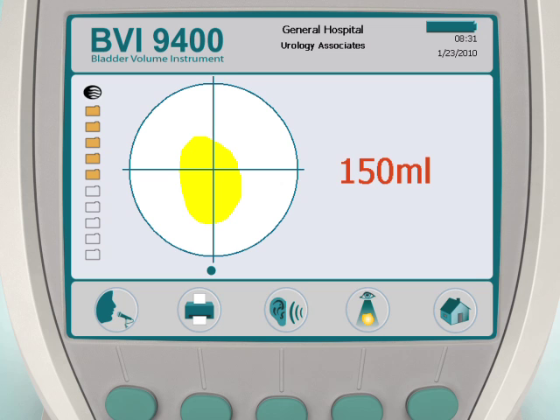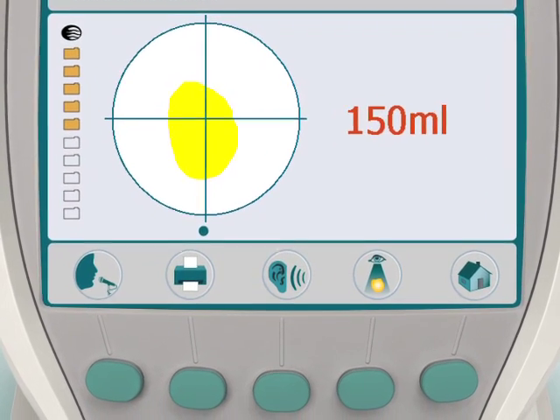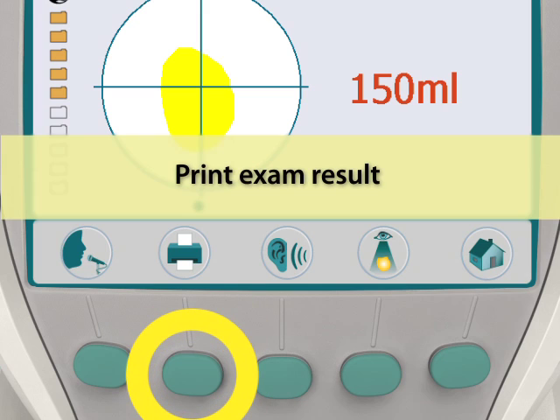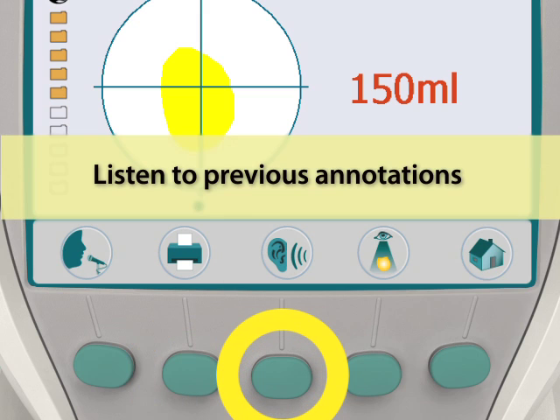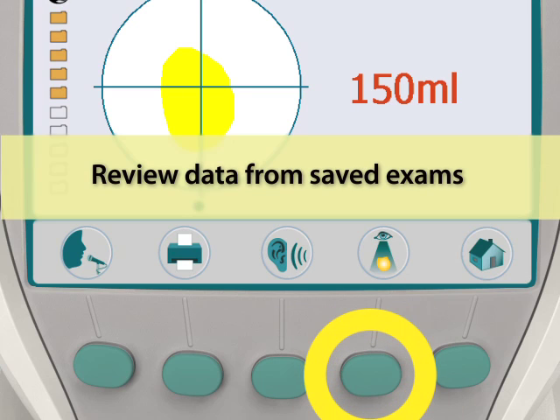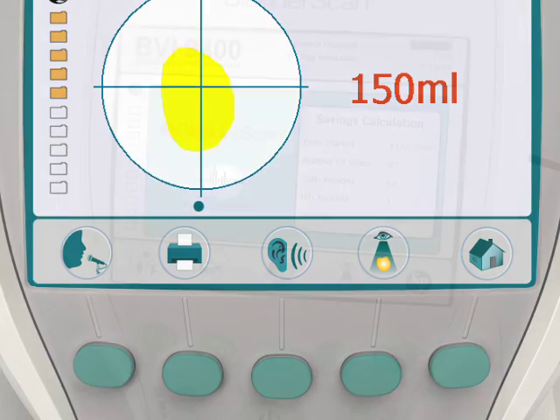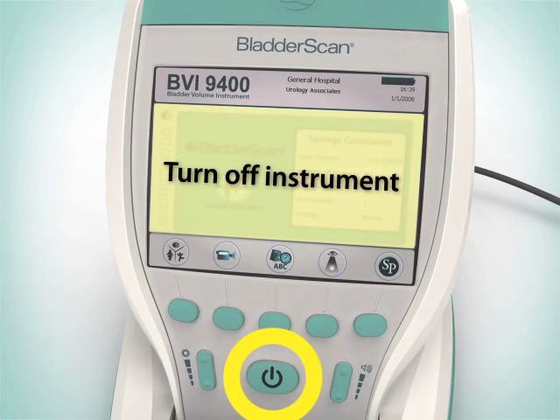When you have verified an accurate scan, the screen will display your results. At this point you may record a voice annotation to save your exam, print the exam result from the onboard printer — please note that printing does not save the scan — listen to previously recorded annotations, view data from saved exams, return to the home screen and perform another scan, or turn off the instrument.